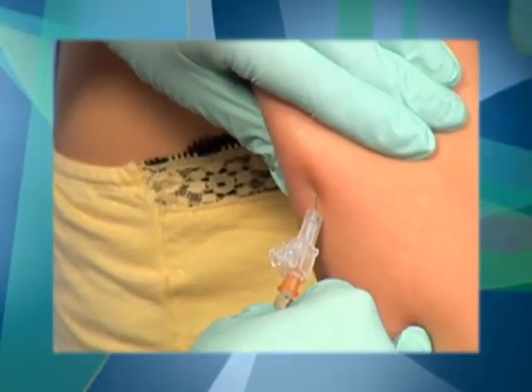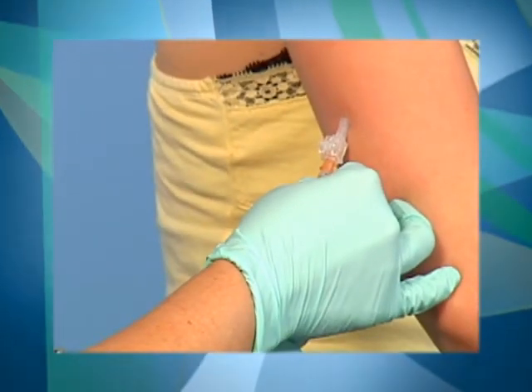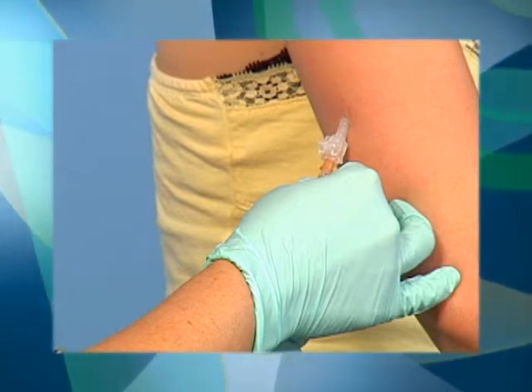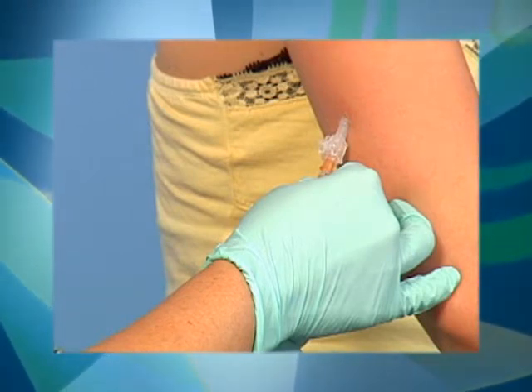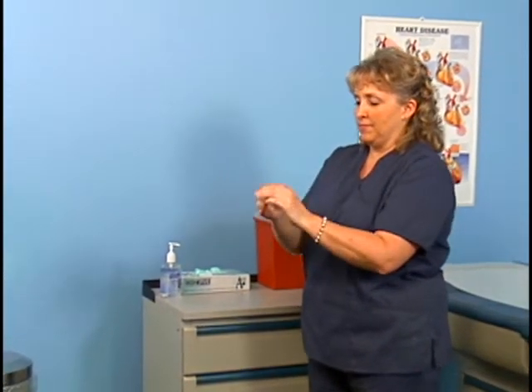The medical assistant is often responsible for administering subcutaneous injections. One of the most common injections administered subcutaneously in the medical office is an allergy injection. The medical assistant will show you how to administer an allergy injection to a patient who is allergic to mixed pollens. Before proceeding, sanitize your hands.